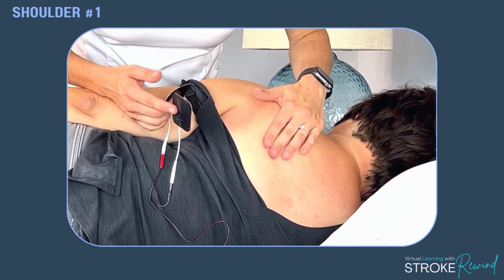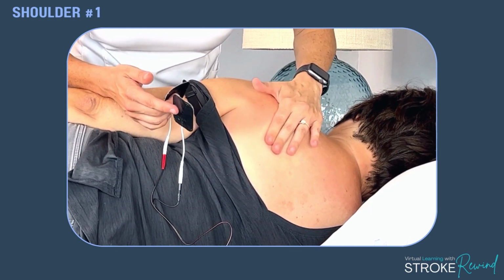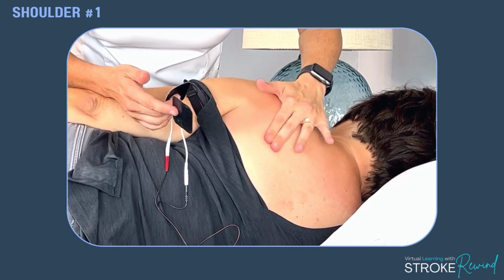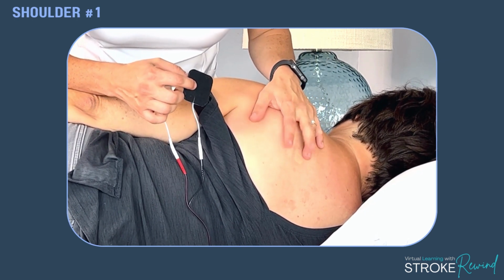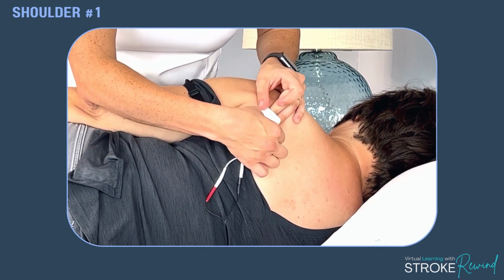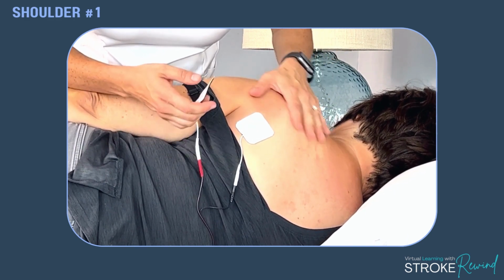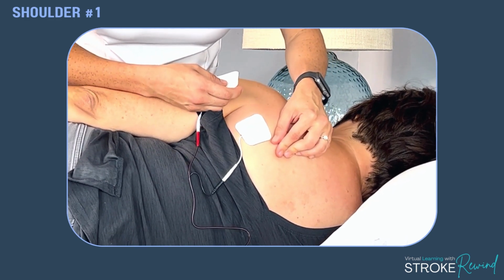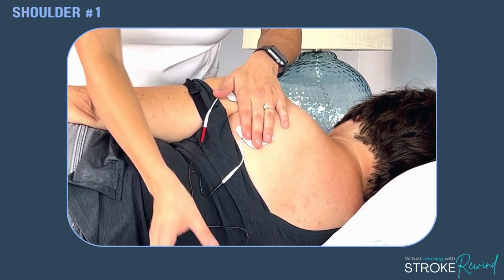So when you're feeling the back of the person's shoulder blade, you can feel a bone here, okay? It's super rigid. It's right here. So all I'm going to do is find a meaty part of the muscle, which I like to go back here. And then for the other one, so here's the bone, here's a meaty part, and then I like to go to the back of the shoulder. So this is the first one.